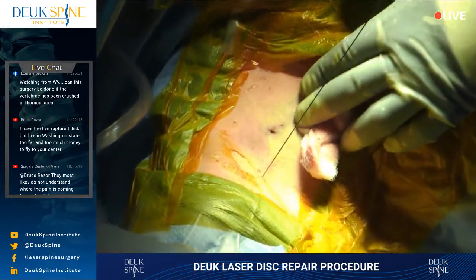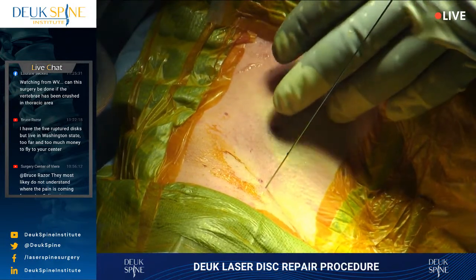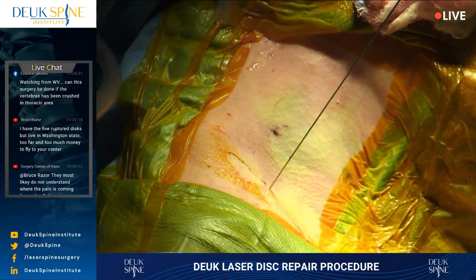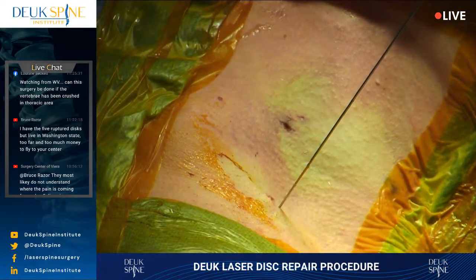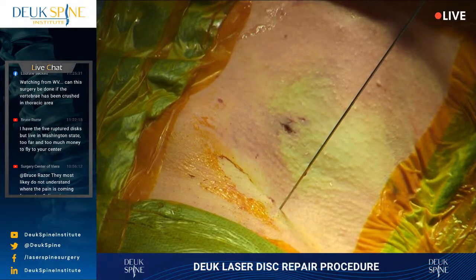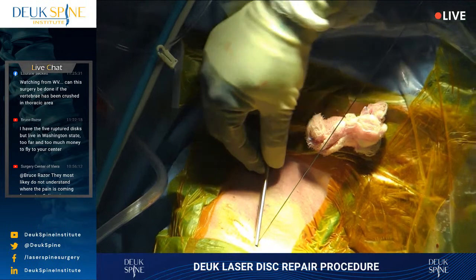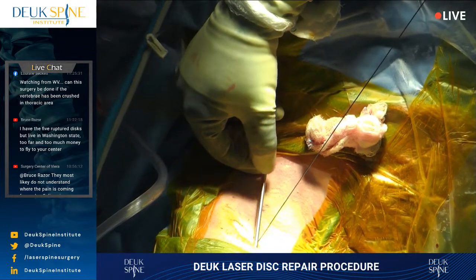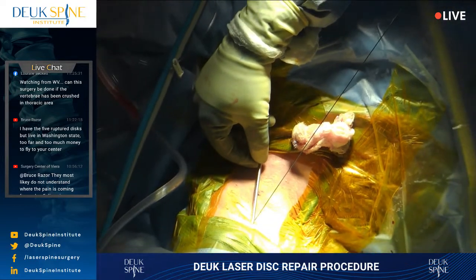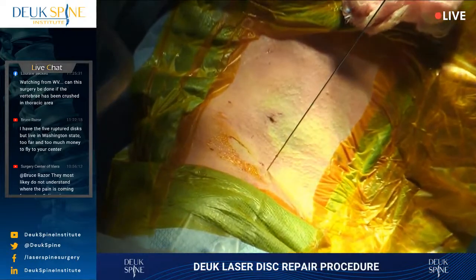By the way, look at the other incision. For those of you wondering, can you see this, Diego? Yes, they're seeing it. A 4 millimeter incision, okay? And just to give you an idea, what would this look like if we did a cervical fusion? It would be an incision about that long. Can you see that? As long as that, where my thumb is, up to the top. Okay? You imagine all the scar tissue and damage that would cause.